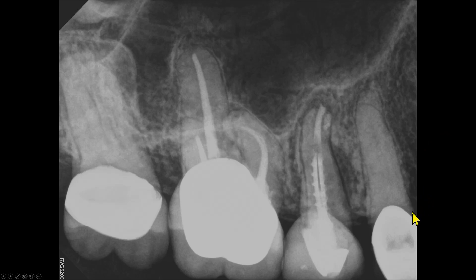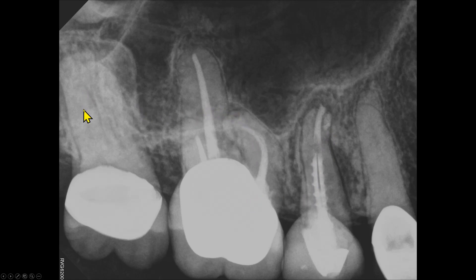This periapical radiograph shows a premolar, an endodontically treated second premolar, an endodontically treated first molar, and the second molar. Let's start with the premolar.